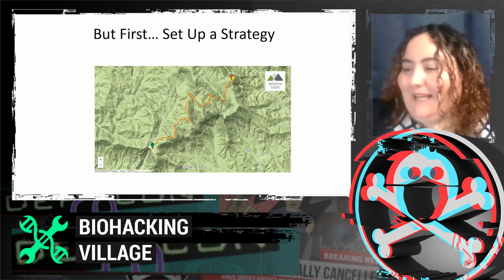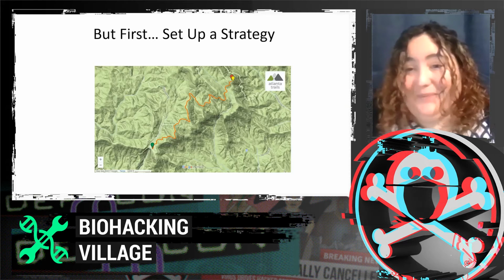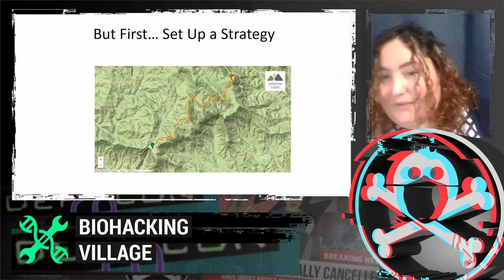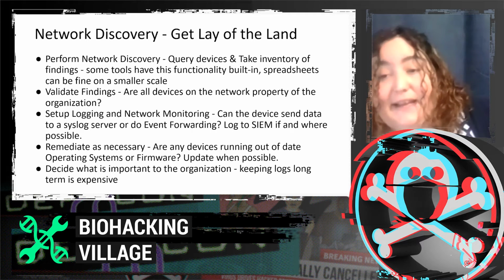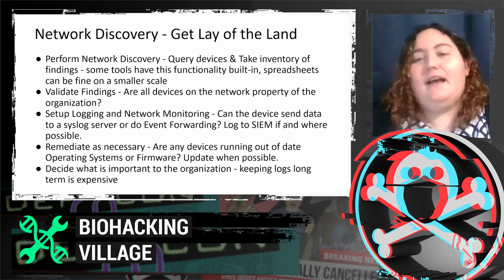So as I mentioned, before we get started, you're going to have to do some planning. Some of this is going to be with network discovery. You're going to want to perform a scan to get the lay of the land and probe a network for all connected devices.